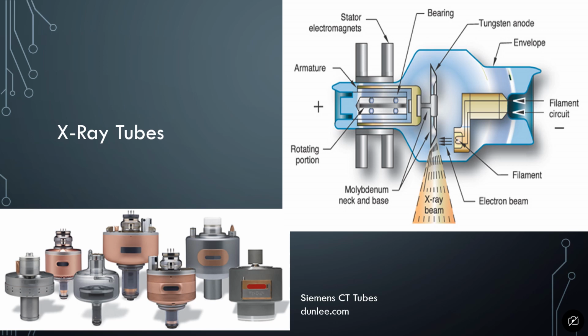So this is an example of a couple of commercial X-ray tubes and then a closer up image of the X-ray tube itself. So this envelope is often made of glass. The entire process is in a vacuum, and we want it in a vacuum because that helps to control the action or the interactions and what happens within the tube.